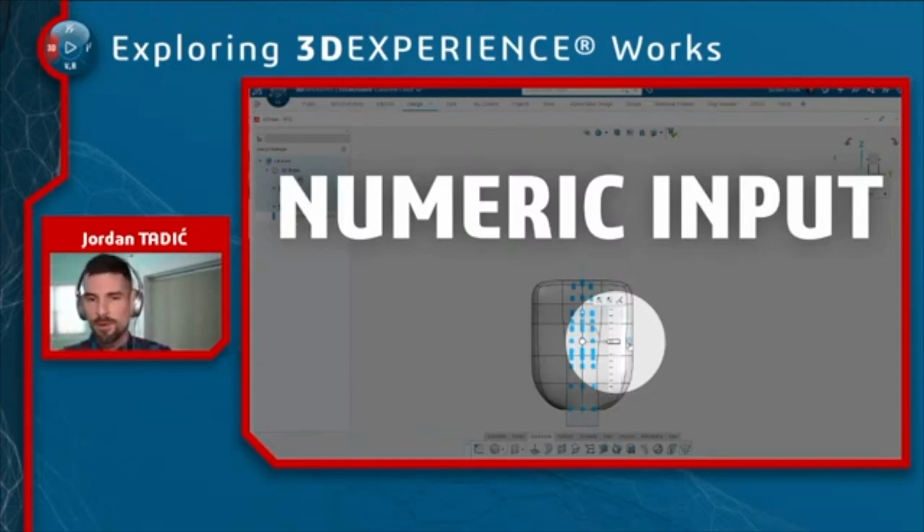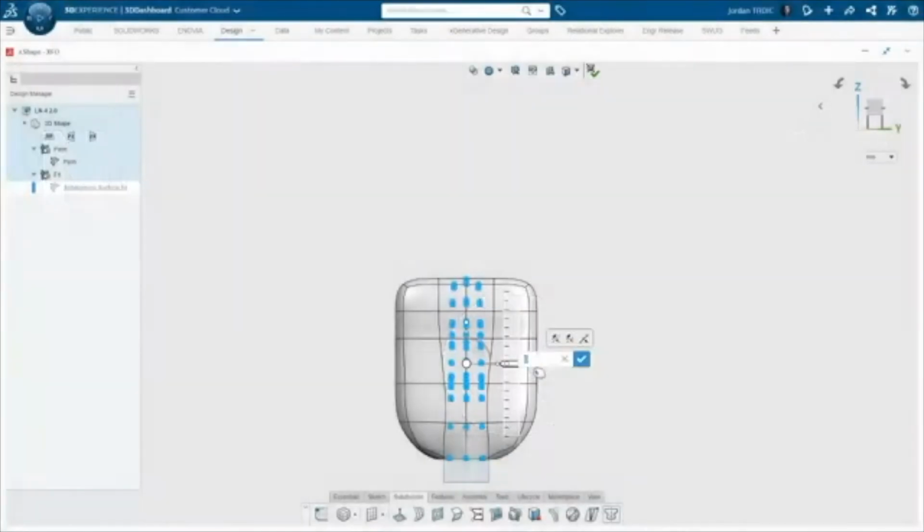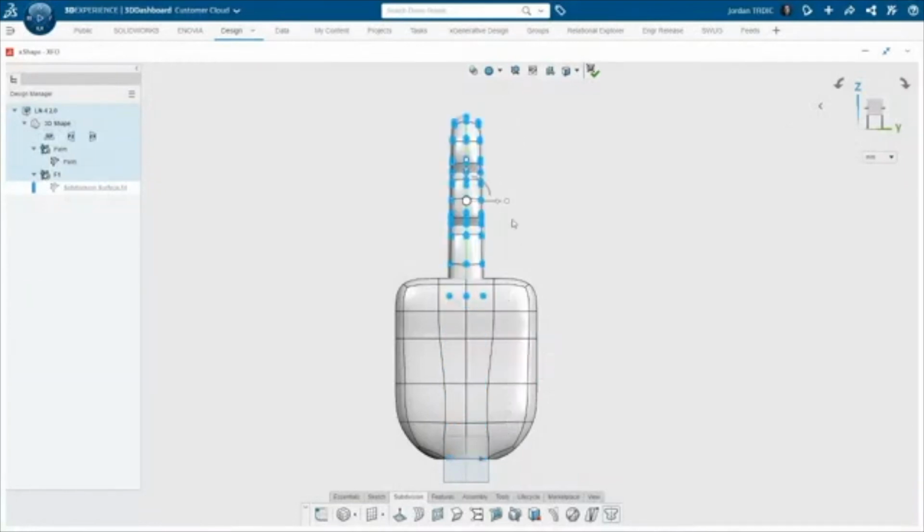So here's a workaround for that. You can type in the exact numerical value that you want. Select the geometry, click an arrow, just a single click on one of the arrowheads of the robot manipulator, and then click the 0 on the ruler that pops up, just a single click. And that 0 is going to turn into a numeric input field that I could key in any value to whatever decimal place value that I need to.